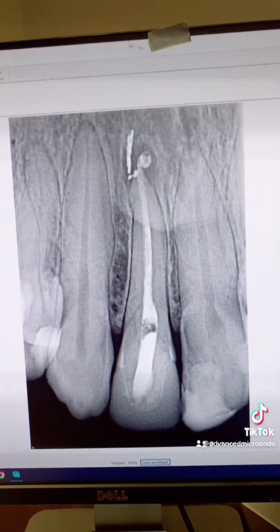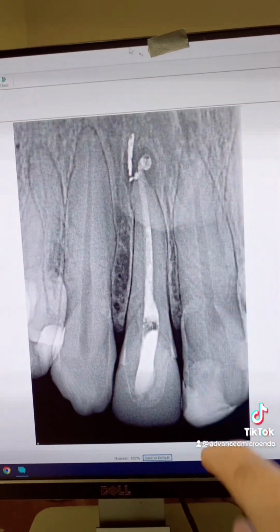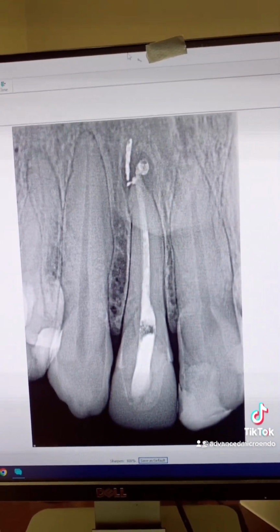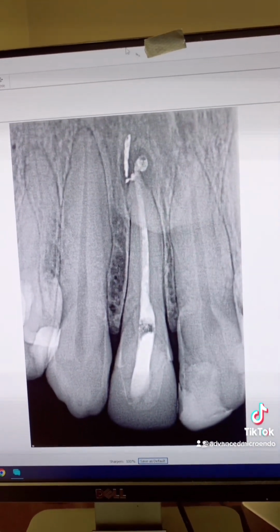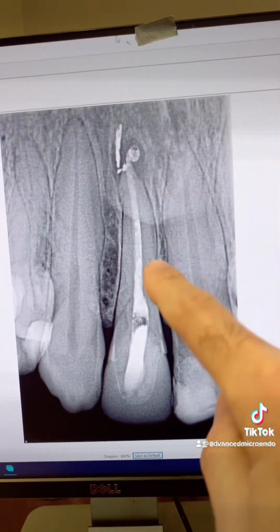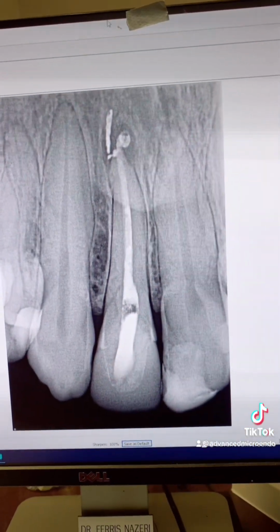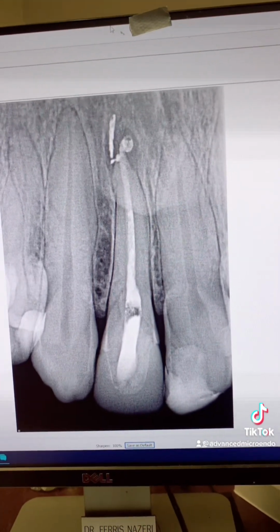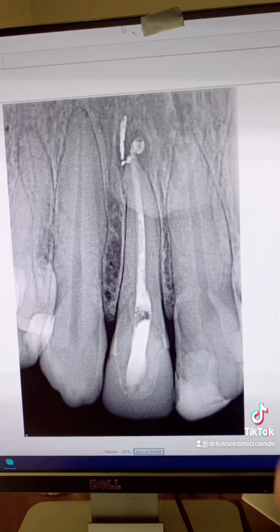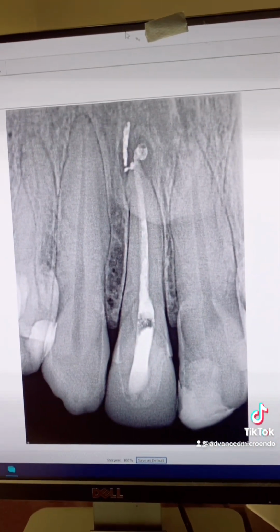And here it is. So today, I went through the porcelain crown, removed the fiber post, removed the gutta percha, and irrigated the heck out of the canal system with full strength hypo, activated sonically and ultrasonically. The apical diameter was over 50, so I placed an MTA plug, followed by gutta percha and sealer, temporized the tooth, and referred the patient back to her dentist. Actually, the patient has an appointment with her dentist today at 1 o'clock. So here it is. This is how you do it. Don't jump into treatment right away. You need to do some investigating sometimes.